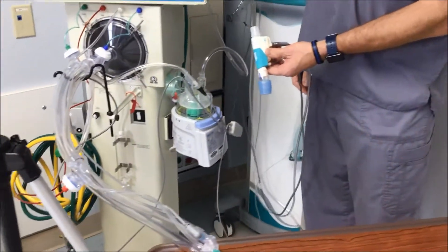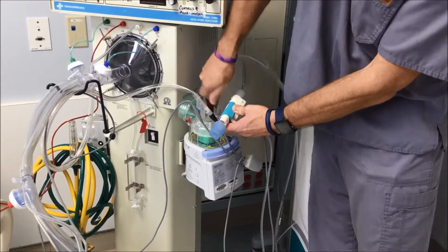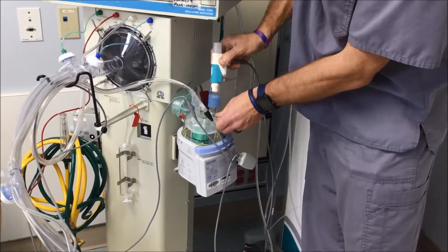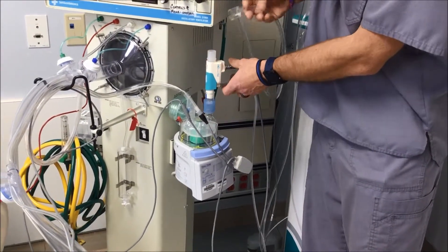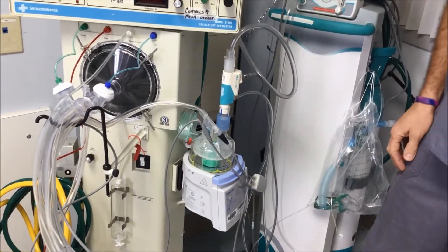Just like on a standard vent, you want to connect it on the dry side of your circuitry. This goes here with arrows facing down — it squeezes on like that. Your air inflow from your oscillator goes on top.